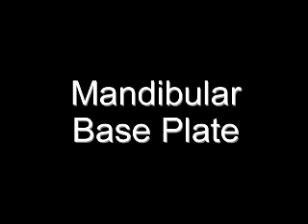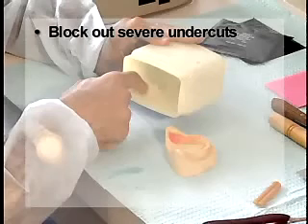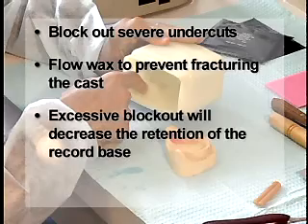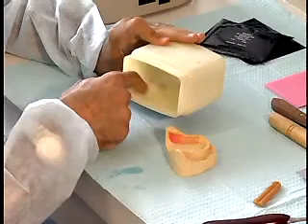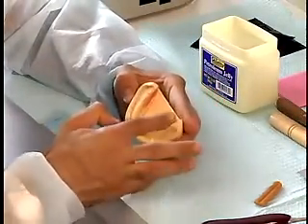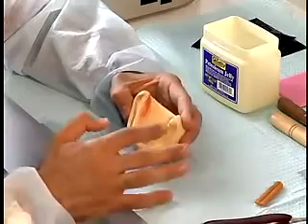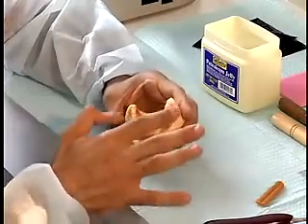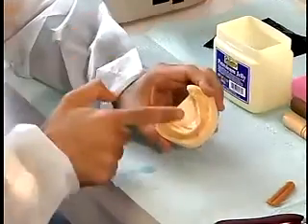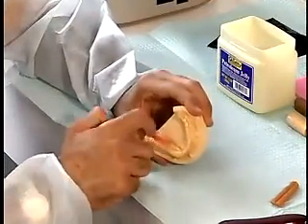Block out severe undercuts on the mandibular cast with hard base plate wax. If the ridge is very thin, flow wax on each side to prevent fracturing the cast. Excessive blockout will decrease the retention of the record base. Lubricate the ridge and the land areas with Vaseline. Remove any gross excess.